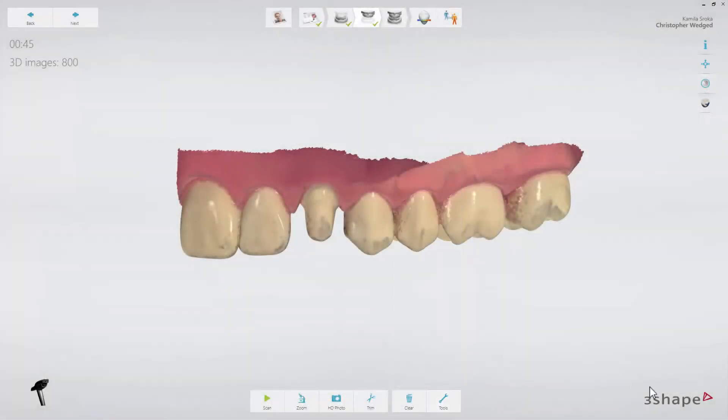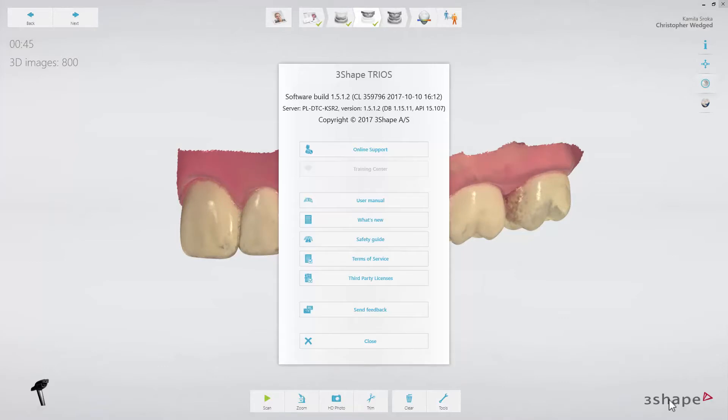No matter where you are in our software, clicking the 3Shape logo gives you access to the help menu, which has all the necessary software information and support functions.